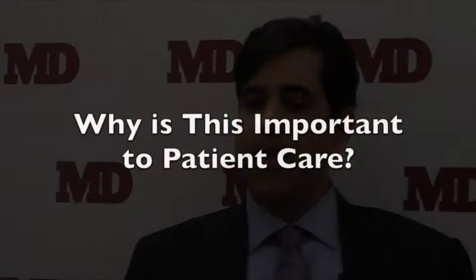So we have in our experimental lab, and now clinically translating, a new form of imaging called molecular imaging, which is this goal of imaging specific molecules and cells in coronary arteries inside living patients. And the reason we're interested in doing that is we're trying to actually understand the impact and importance of inflammation in driving plaque complications and stent complications. And until now, we've not really had a way to image inflammation inside human coronary arteries.